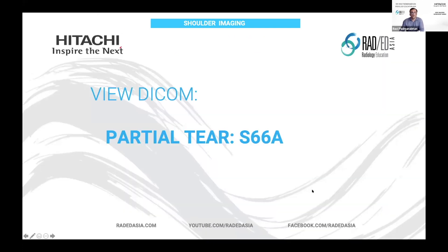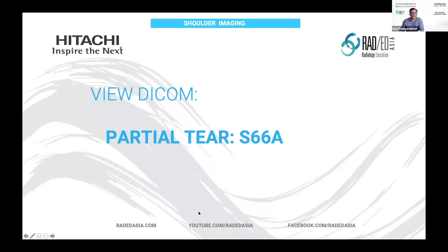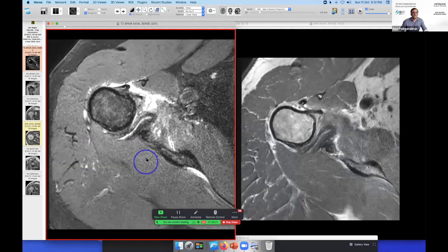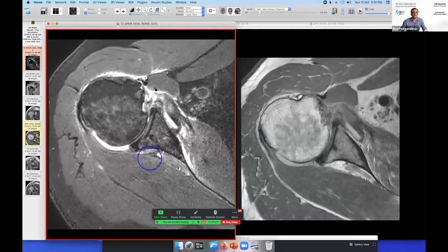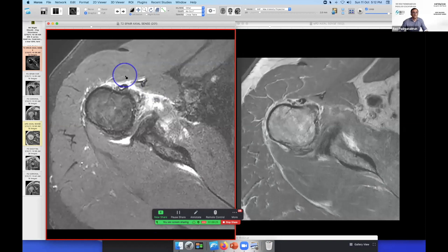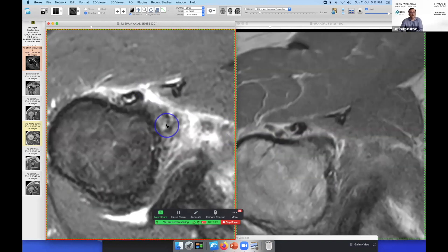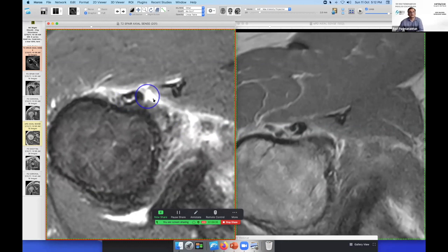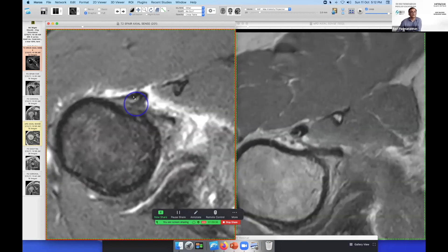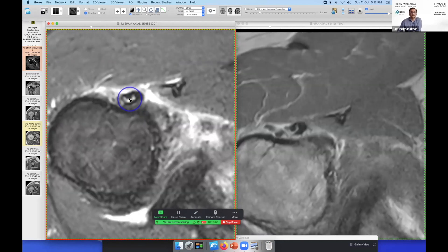Let's look at a case. Here's the biceps tendon and you can appreciate that the signal within the biceps tendon is the same as fluid signal. So this would be described as a partial tear of the extra-articular portion of the biceps tendon.